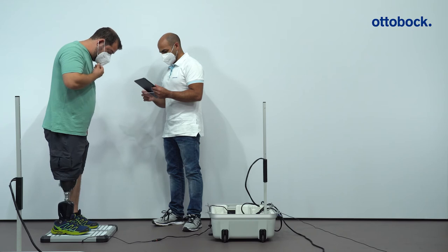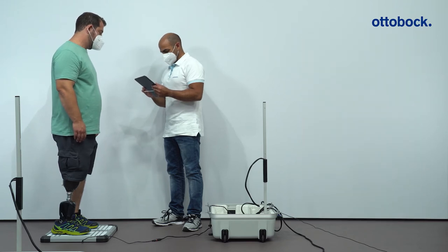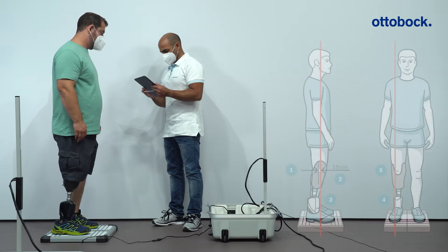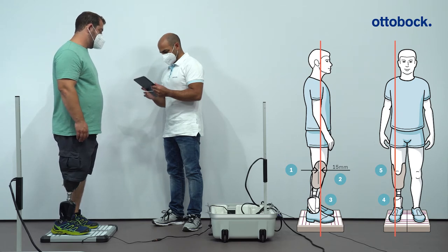The Empower setup app includes alignment recommendations for the static alignment. Please follow the instructions in the app step by step. First, check the length of the prosthesis. Then determine the pivot point for the knee and mark it on the prosthetic socket.